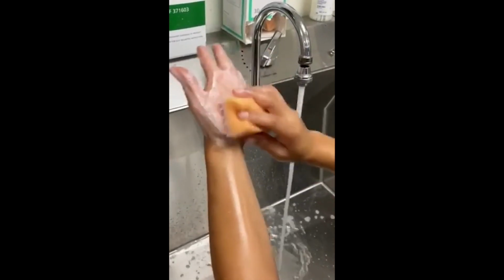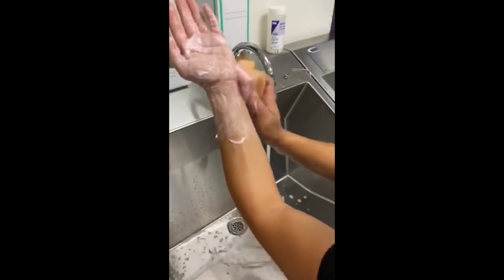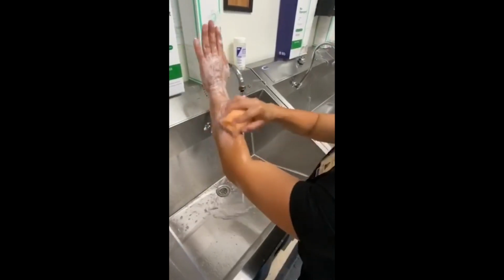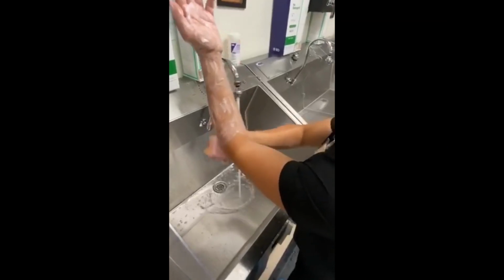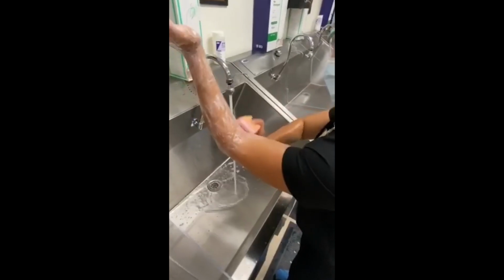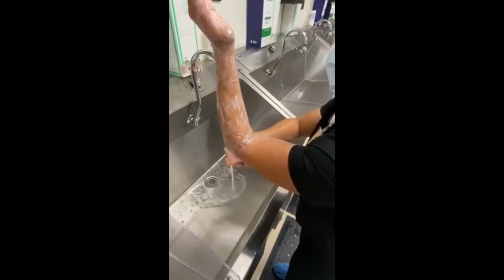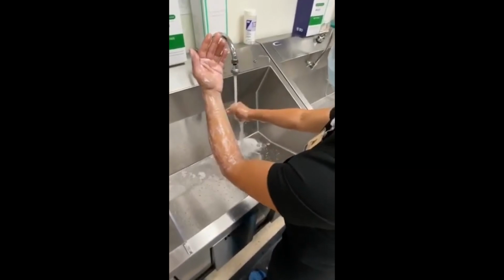So we are approaching the palm. This is where we begin our circular motion of the brush. On the palm, turn your hand to the back side, and then a circular motion at the wrist going down towards the elbow. And all you're doing is pivoting your arm back and forth. Again, be mindful not to straighten out your arm the whole time that you are going from wrist to elbow. Keep it at not a 90 degree, but maybe a 35? I don't know my angles, sorry.